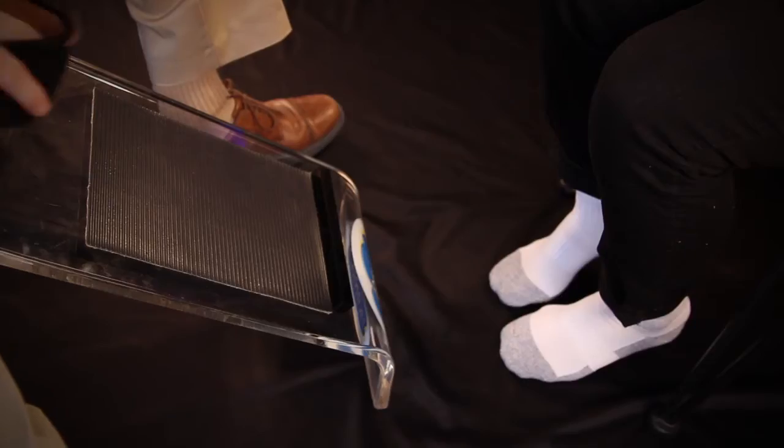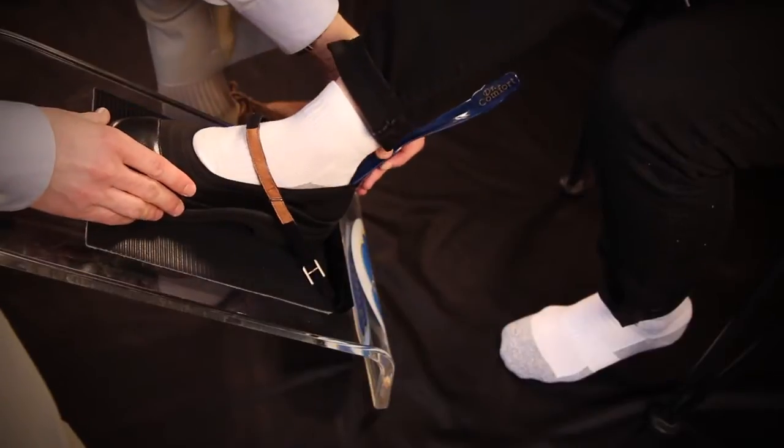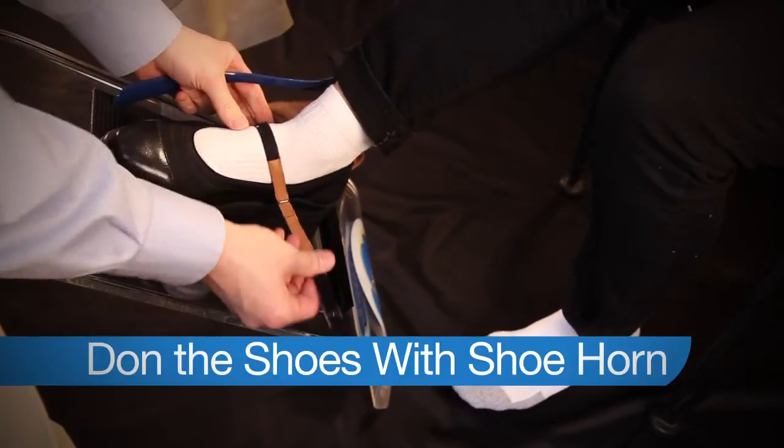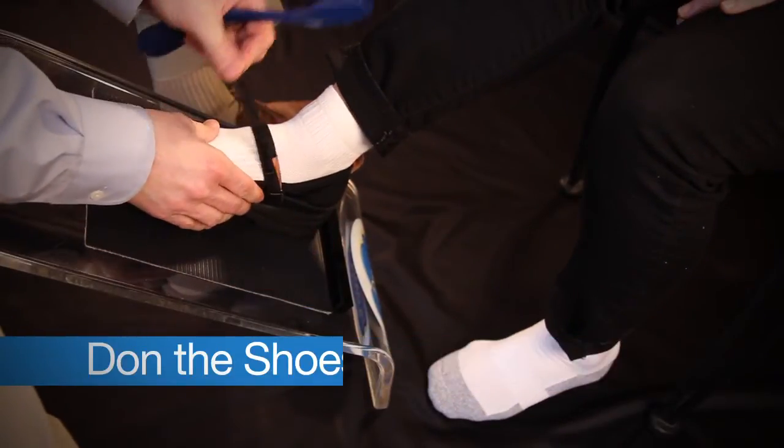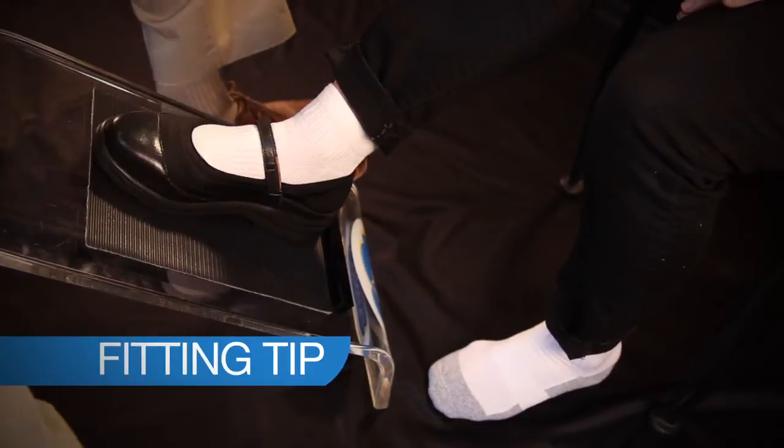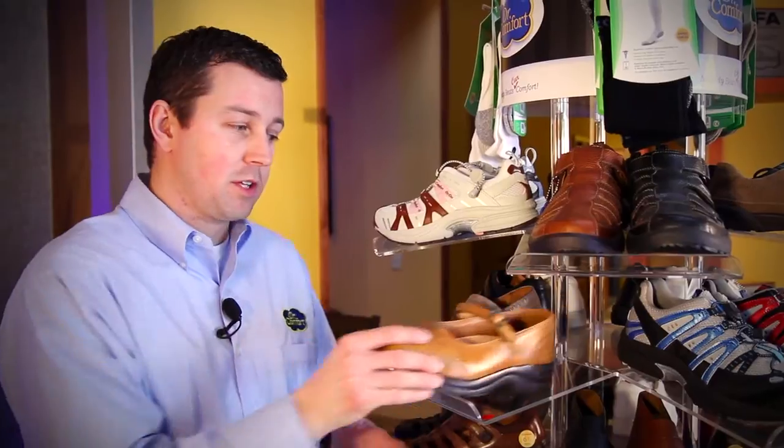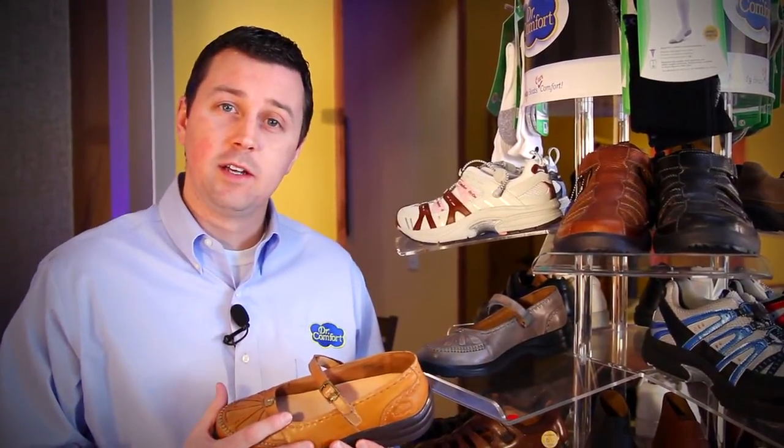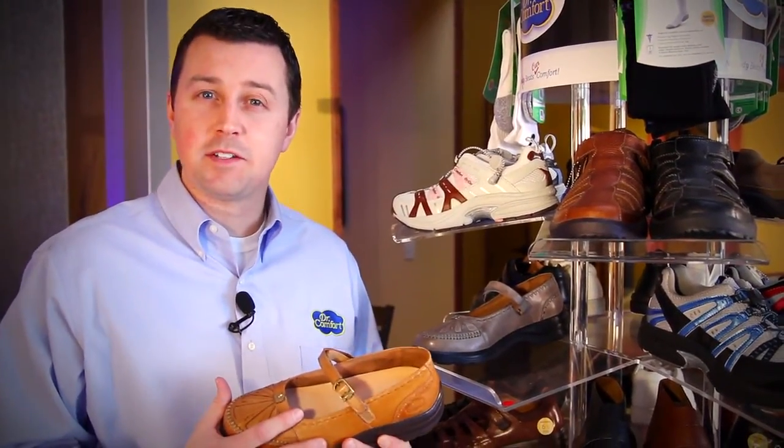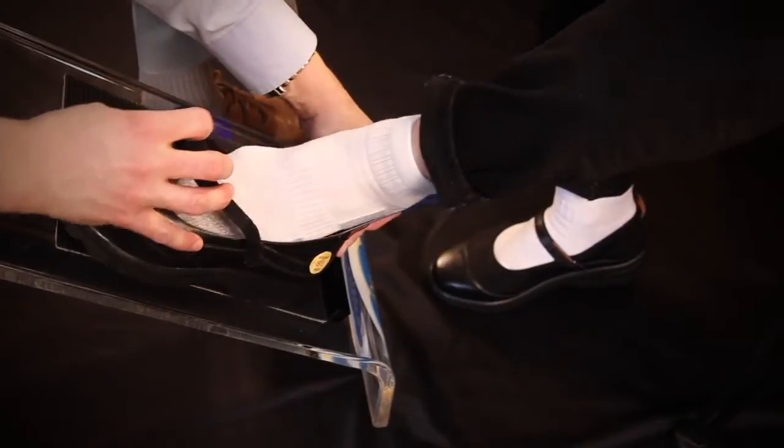So I will be removing the 8 1/2 wide, which happens to be the flute off of the display rack. If you'll notice, I'll be donning the shoes for her using the shoe spoon or shoe horn. A fitting tip in this situation is to assist the patient with donning and doffing the shoes. This will ensure that the patient is putting the shoes on correctly and it will actually speed up the process a little bit next to her left.